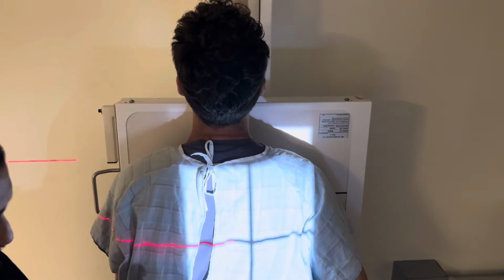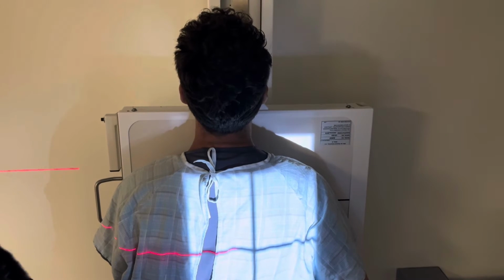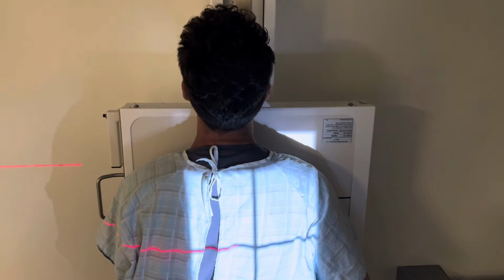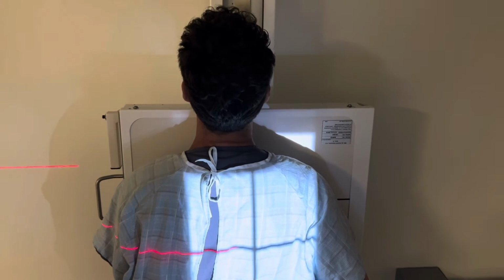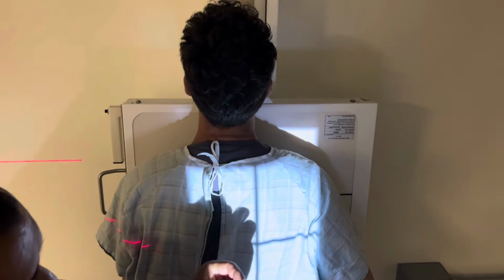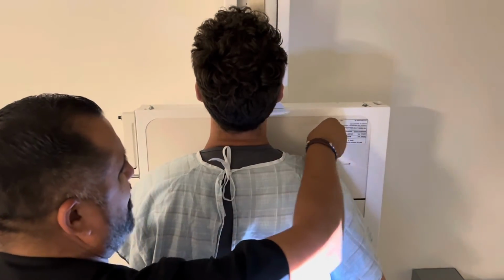Okay, and of course, it's not sticky anymore because I was messing with my markers. So let me put some tape on it if I can. All right. Oh, we got a marker right here. Thank you. We have markers that just appear out of nowhere. That's okay. Look at that. All right, magic. X-ray is magical. You guys got to remember that.